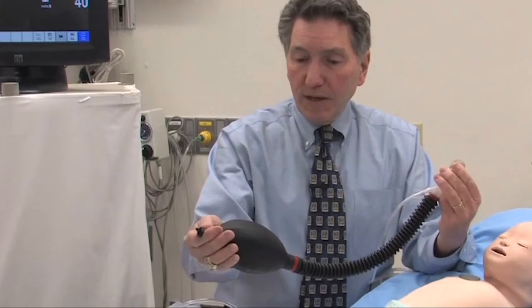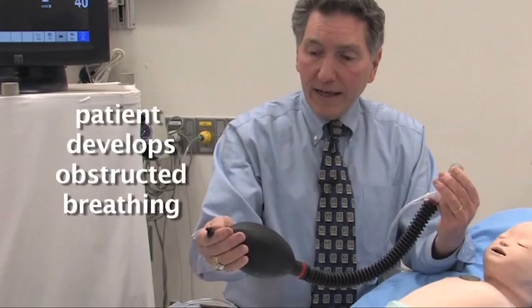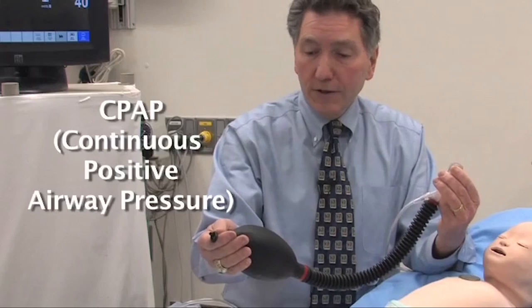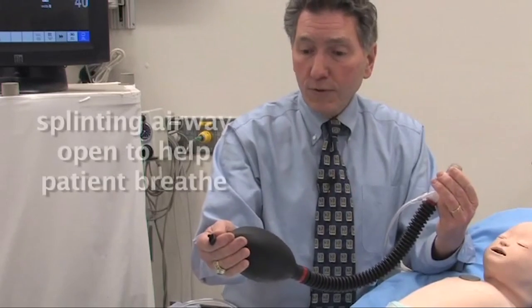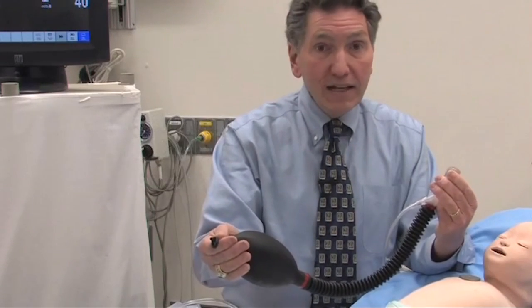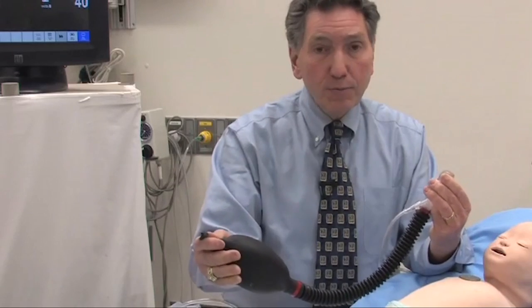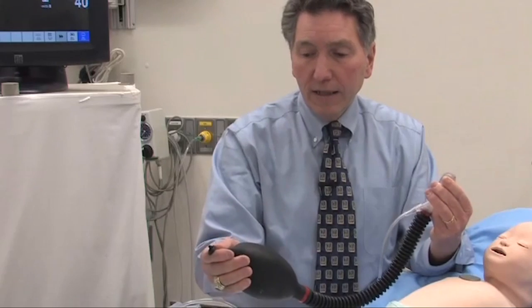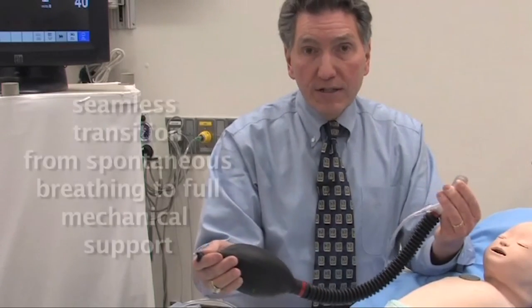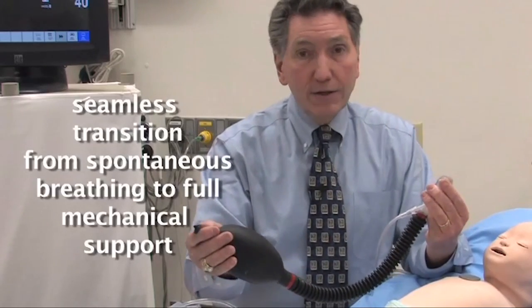Suppose the baby needs a little more assistance — for example, someone being sedated for a procedure who gets a little obstructed after midazolam or fentanyl. I can increase the pressure, turn up the CPAP, and the baby can still breathe spontaneously with 5, 8, or 10 centimeters of CPAP splinting the airway open. If I give even more sedation and the baby becomes apneic, I can start mechanically ventilating the patient with the same system, adjusting pressures via the pop-off valve. It's a seamless transition from spontaneous ventilation to full mechanical support — back and forth — which you really can't do with the self-inflating bag.